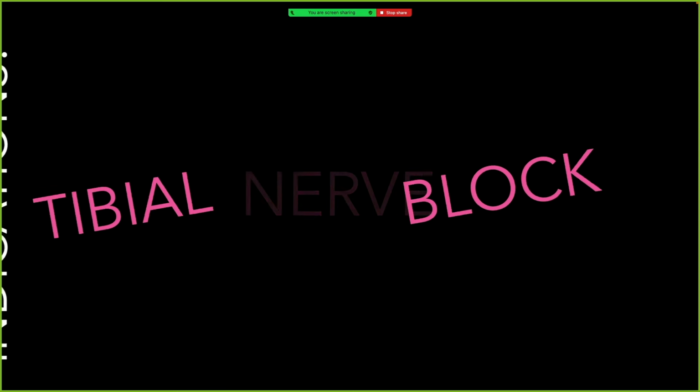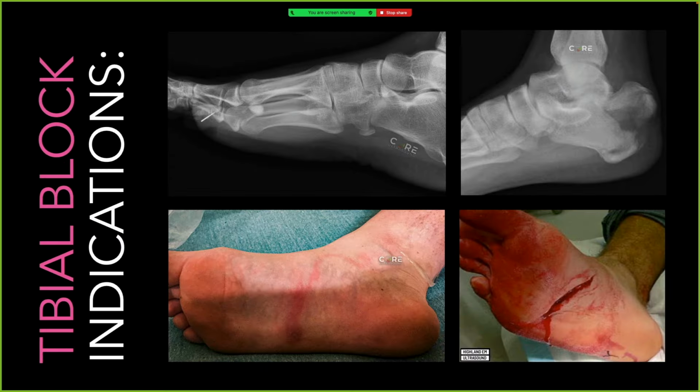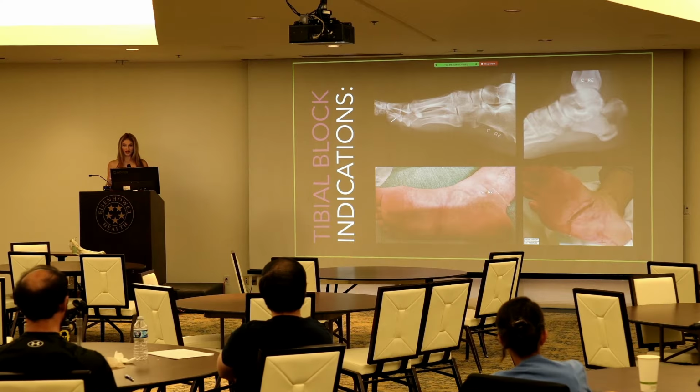Great. Now, tibial block, the ankle one. I don't know if you guys know this, but the calcaneus is basically completely innervated by the posterior tibial nerve, which if you block that, it fixes the pain for most calcaneal fractures. Put that in your armamentarium.